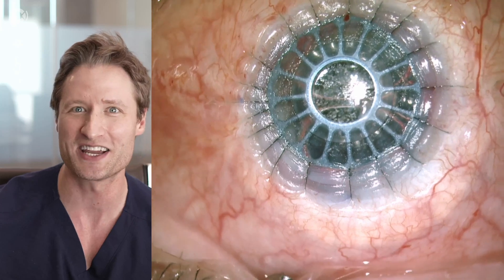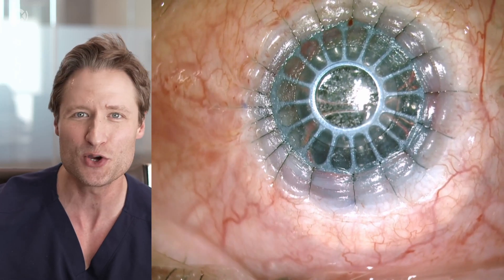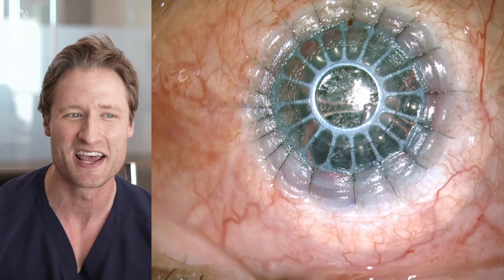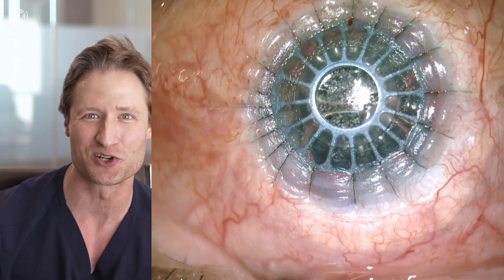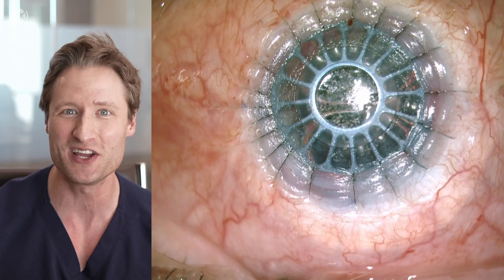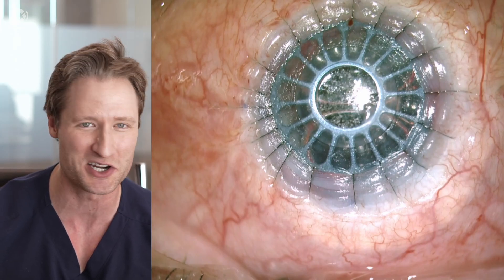This is what the eye looks like at the end of the operation. It's a beautiful image — a gorgeous prosthetic, really an exciting and interesting thing to look at. It's a fun experience to put in. I saw our patient this morning and she's doing very well with the surgery, so it has ended up being a gratifying experience.